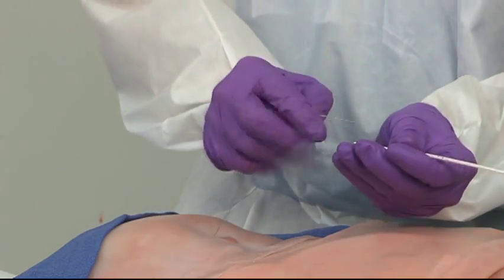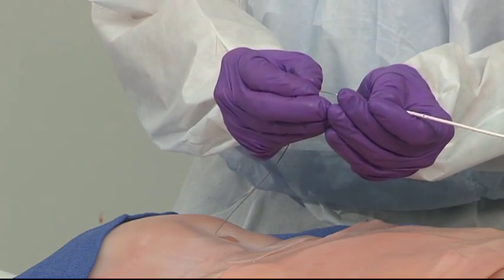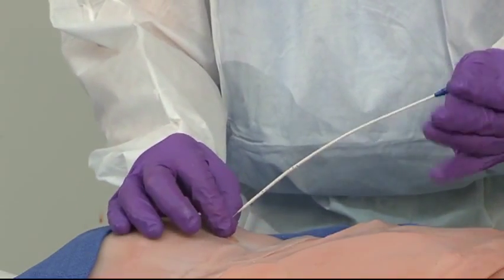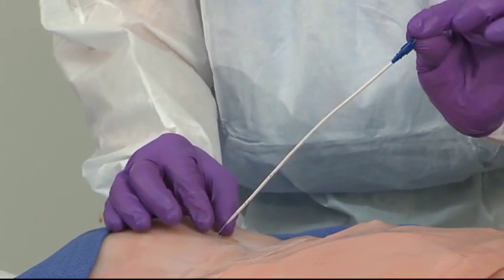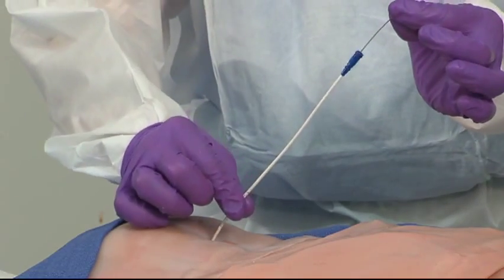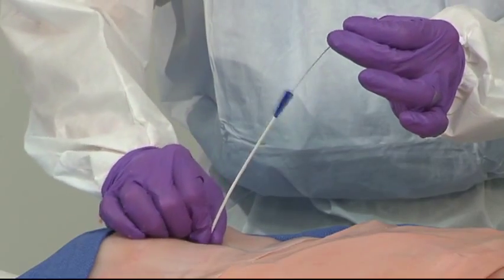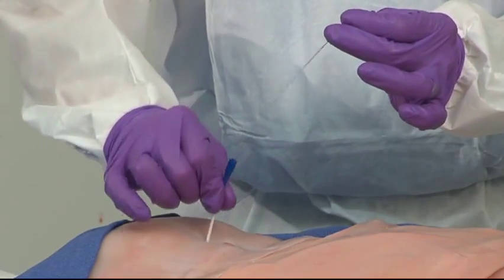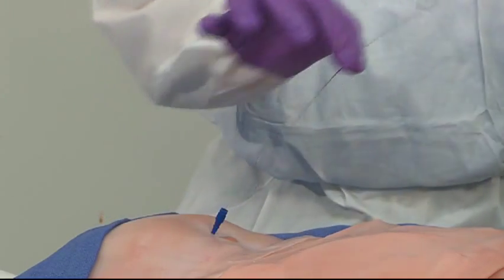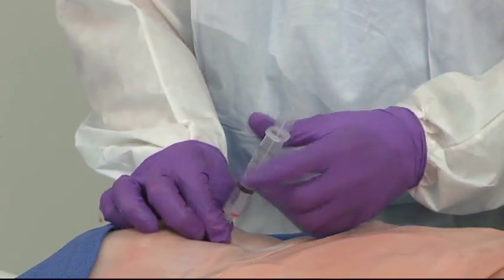We're going to thread the catheter in over the wire. This diagnostic peritoneal catheter, which comes in this kit, has holes all the way around it coming up about halfway. Maintaining control of the wire both below and above the catheter, I insert the catheter using a spiral downward motion, advancing it into the abdominal cavity. This is going nicely and easily, and once I have this in place, the wire comes out and then I aspirate to see if I have blood in the abdomen.